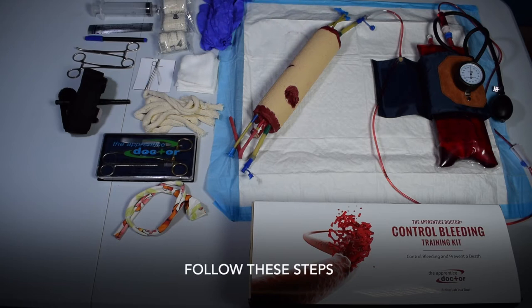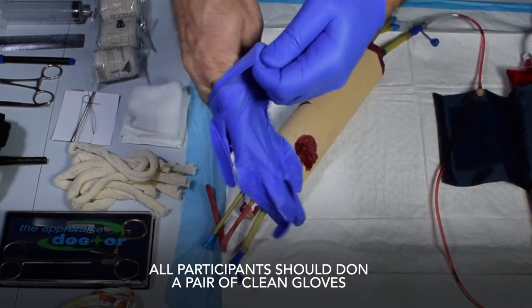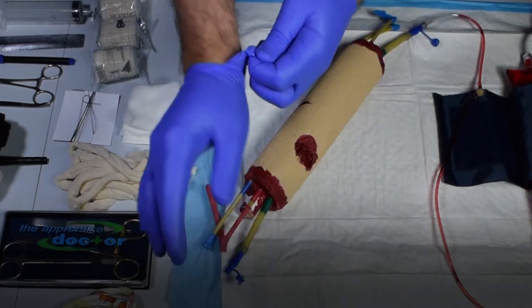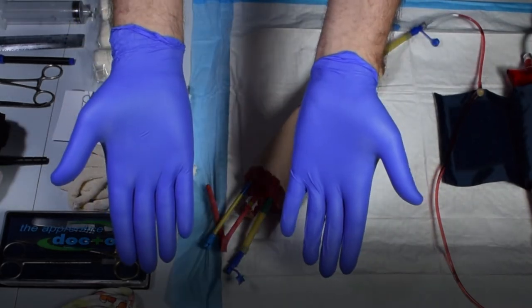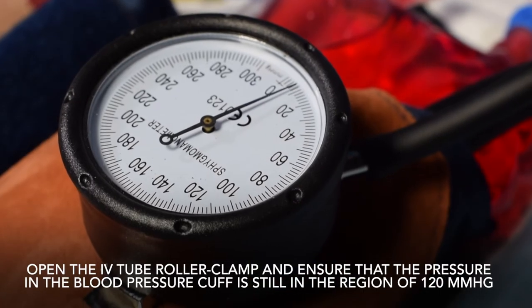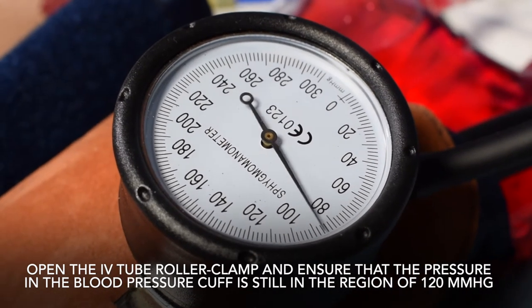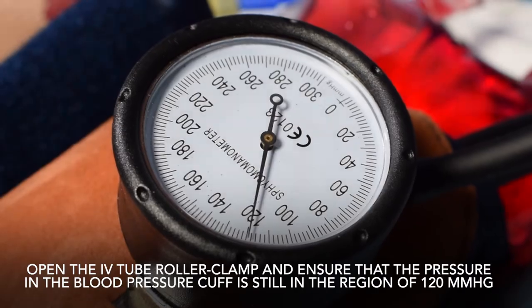Follow these steps. All participants should don a pair of clean gloves. Open the IV tube roller clamp and ensure that the pressure in the blood pressure cuff is still in the region of 120 mmHg.